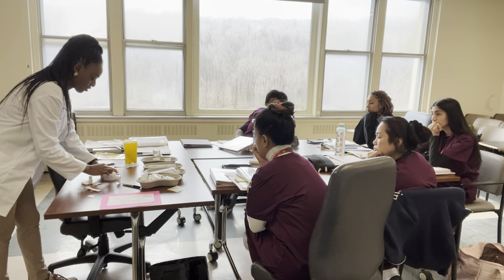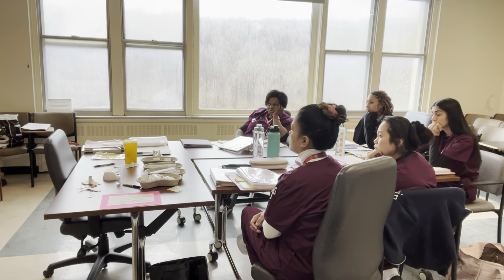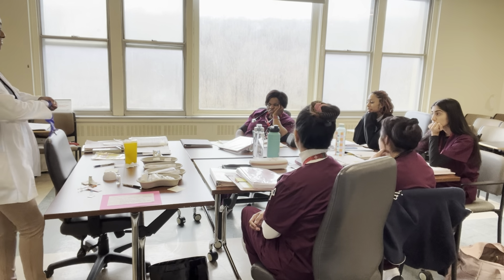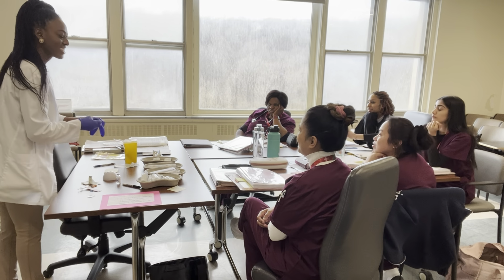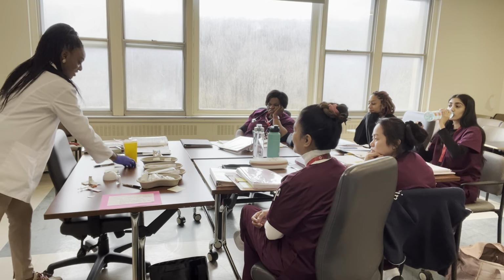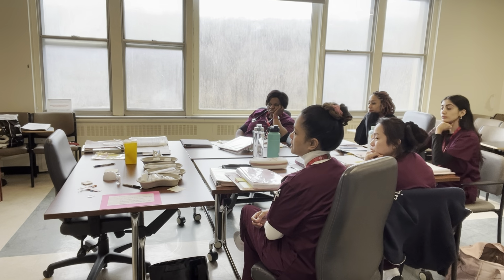So I clean in a circular manner. The only thing your teacher's missing is what? Oh, good. So I shouldn't have even gone into the room. So we need to have gloves. I was trying to see if anybody was going to point it out, because my students walk in without gloves. So remember, you can never give an injection without gloves.